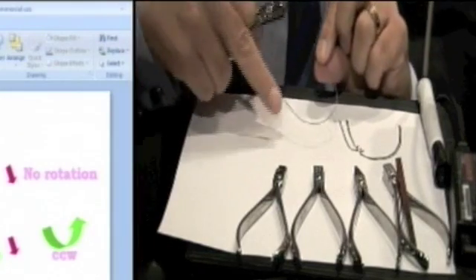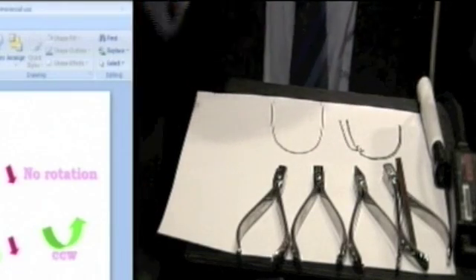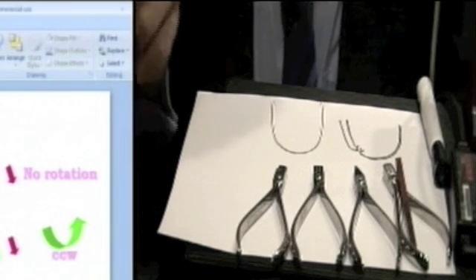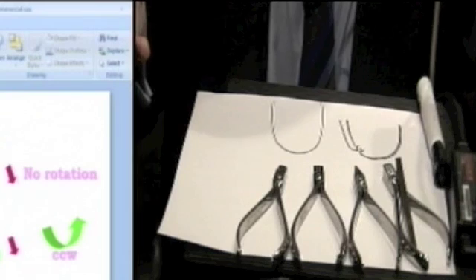So that is an offset for the transverse. When do you use that? A molar that's rotated, very nice to derotate the molar. A crossbite tendency.